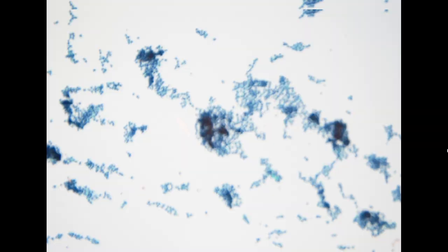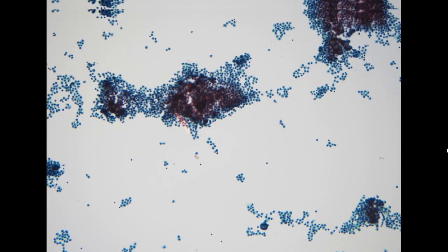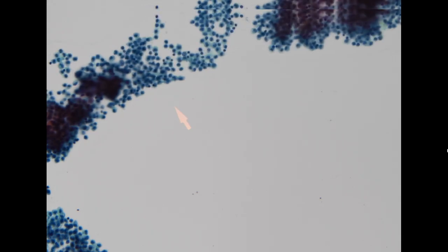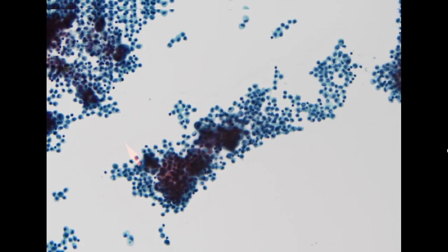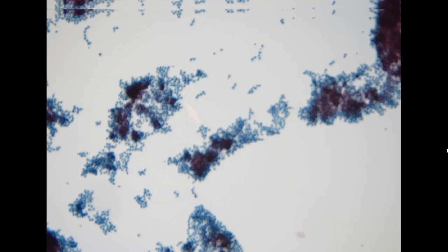In our lab, we usually want a staining pattern where in the normal cell population the chromatin is less dark than this. So when we see a malignant cell cluster, we can appreciate the true hyperchromasia. Try to turn down your hematoxylin stain if you can.